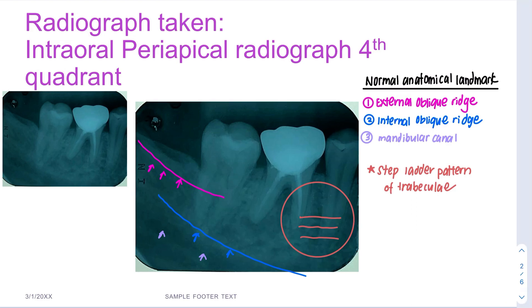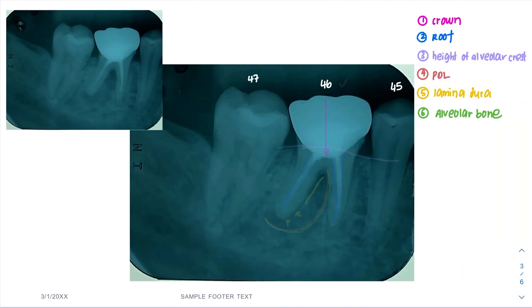Next, we move on to the tooth of interest. There are three teeth to present here: 45, 46, and 47. My tooth of interest is 46.